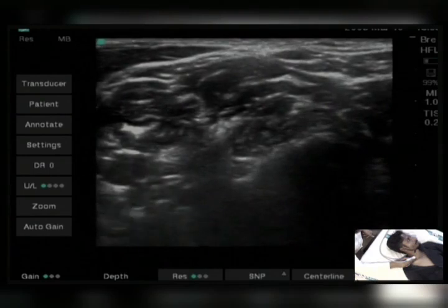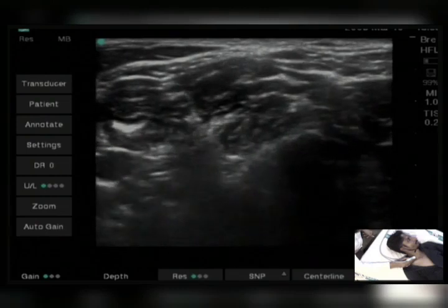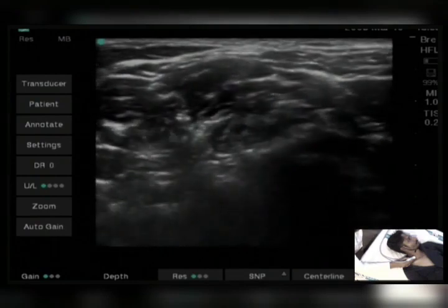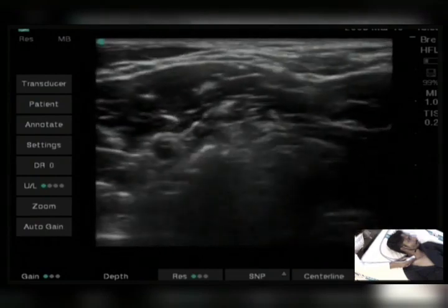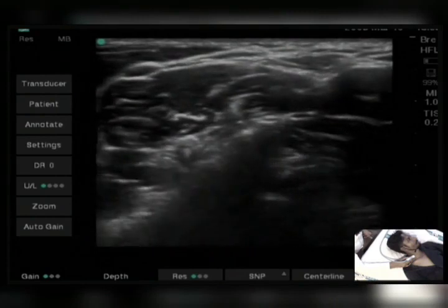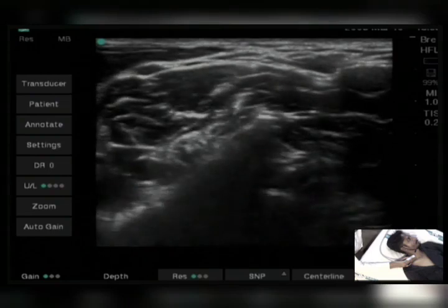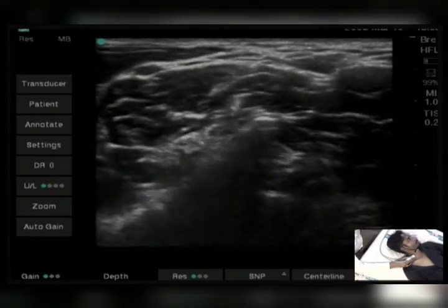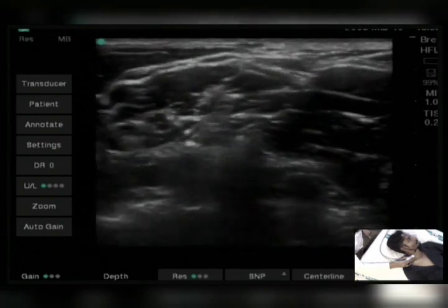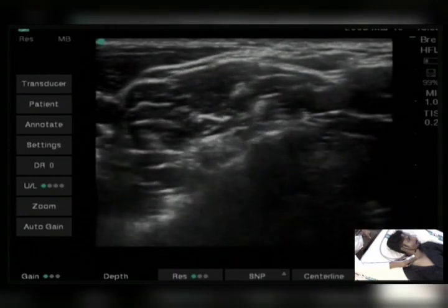See here, you can visualize the plexus, and one more thing is this is the posterior tubercle of C7 vertebra, and thereby this is the lower trunk, thereby it is the C7 root. When we go upward, I think this is C7, and the posterior tubercle is found over here, the anterior tubercle is absent, so that we can visualize the vertebral vessels. Can you appreciate the vertebral vessel? See, you can see some pulsatile structure. Okay, so this is the C7 root because of the presence of vertebral vessels.